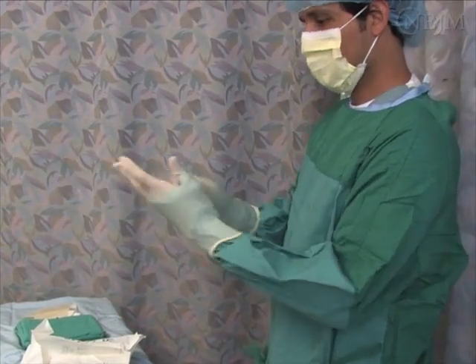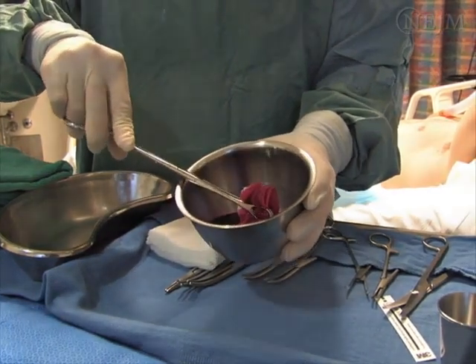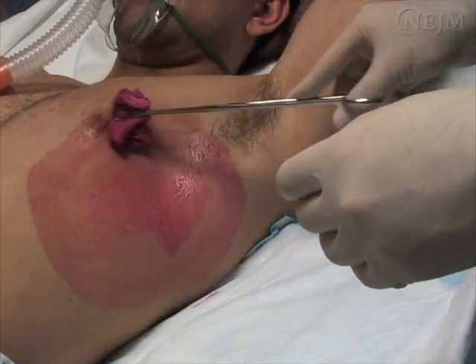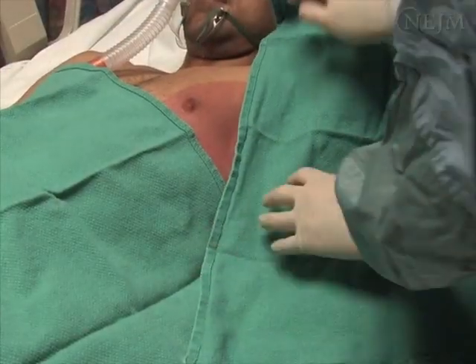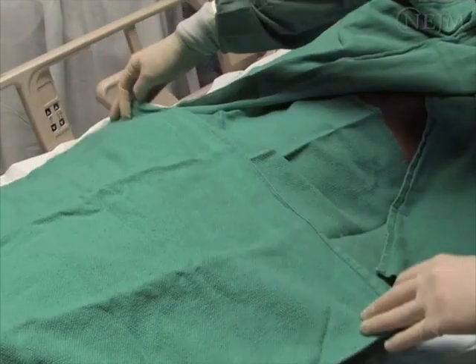Once full barrier precautions are employed, use the chlorhexidine cleaning solution and sterile gauze to create a large sterile field on the patient's skin. Cover the field with sterile drapes so that only the procedure site is exposed.